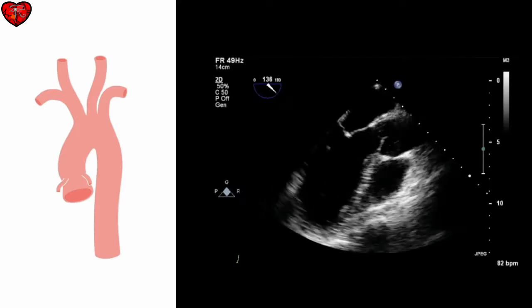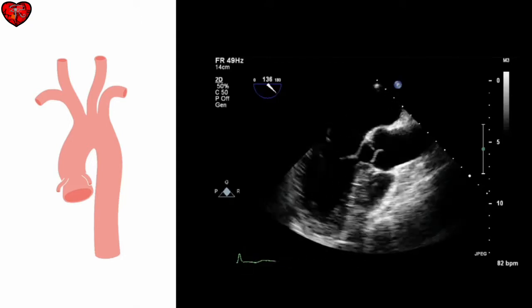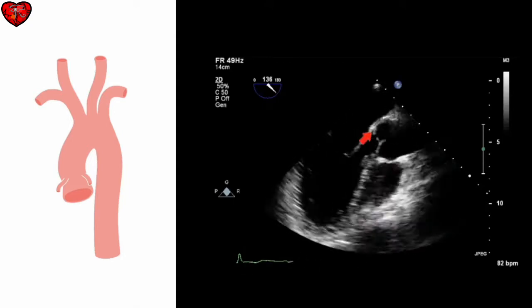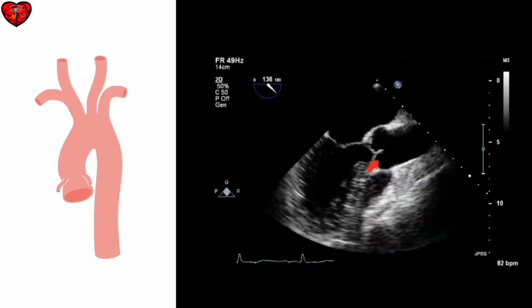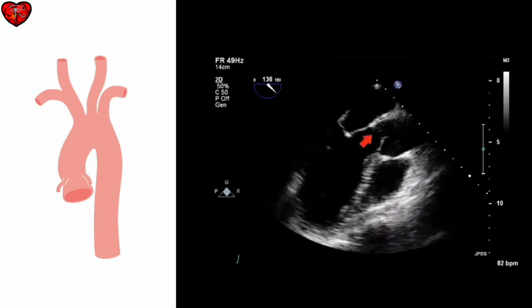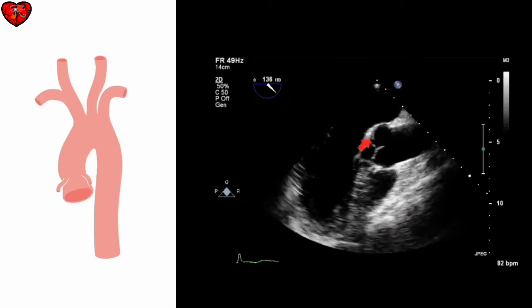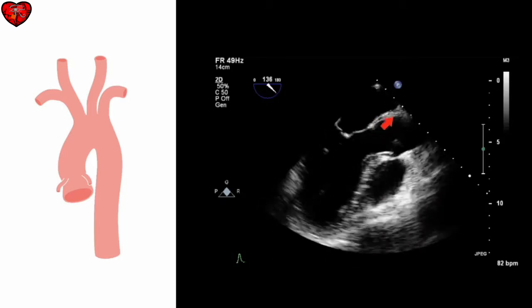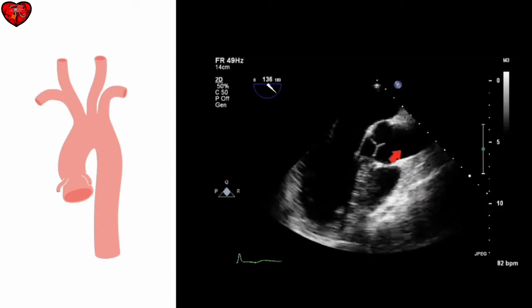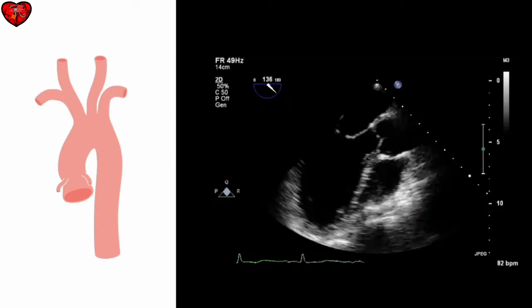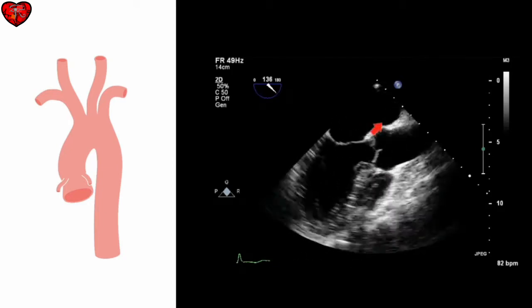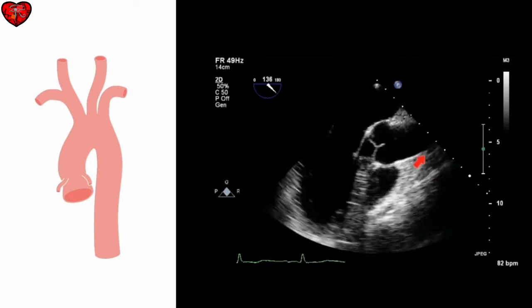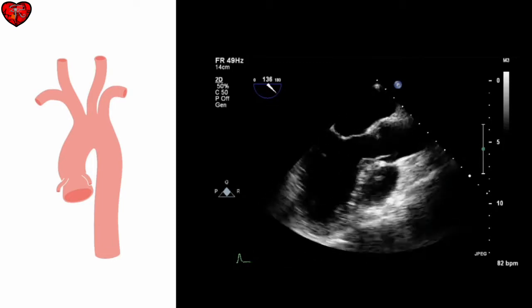The aorta begins at the aortic valve, which is well seen on this mid-oesophageal long axis view. We can measure the diameter of the aortic root at the level of the aortic annulus, between the attachment points of the aortic valve cusps. We can also examine the aortic root and take measurements at the level of the sinus of Valsalva, the sinotubular junction, and in the proximal tubular ascending aorta.